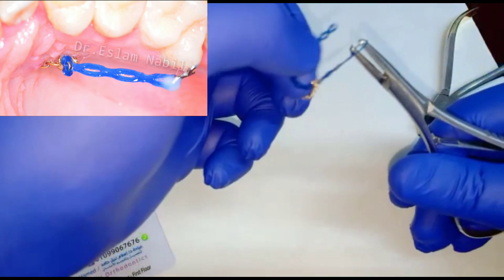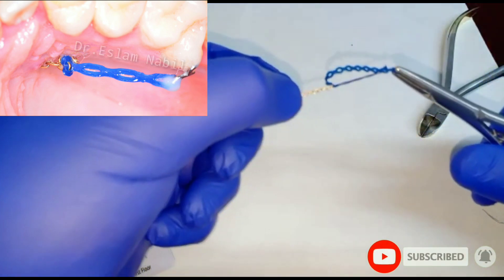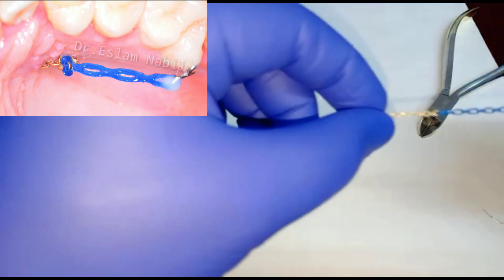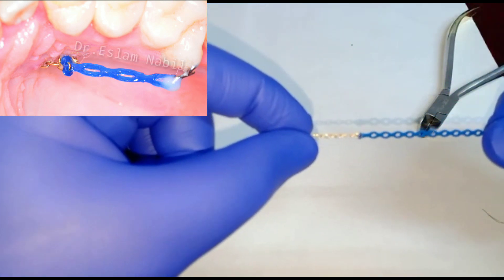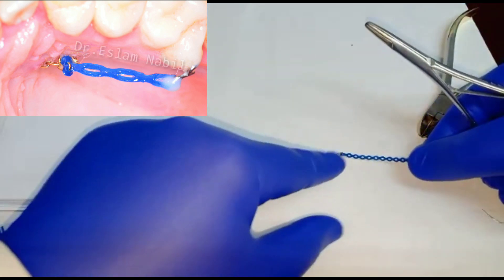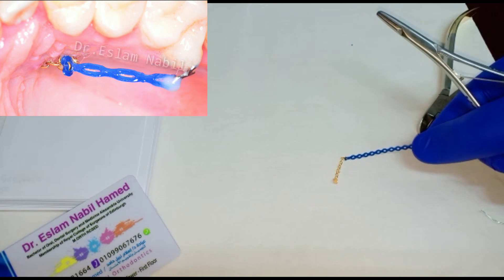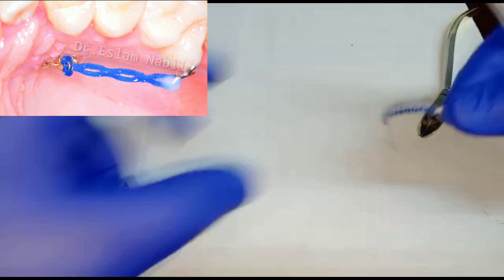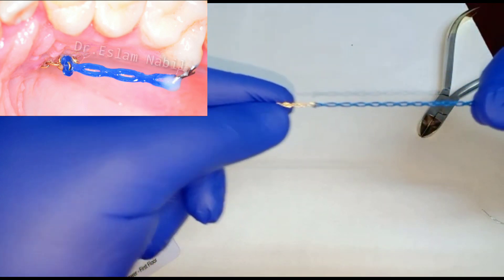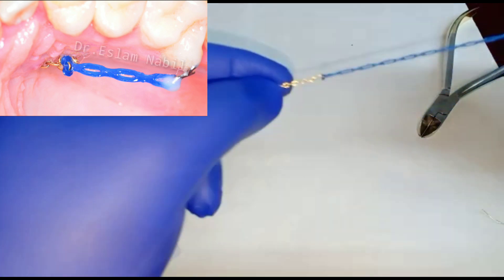Holding the other side of the power chain — make sure the gold chain is held. Now we tie the power chain to the gold chain, and we can do the traction.